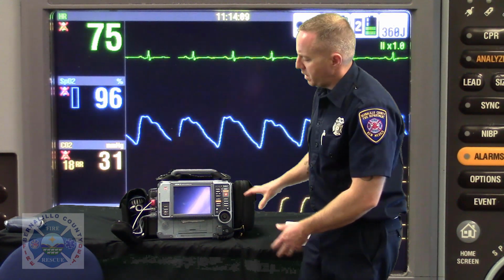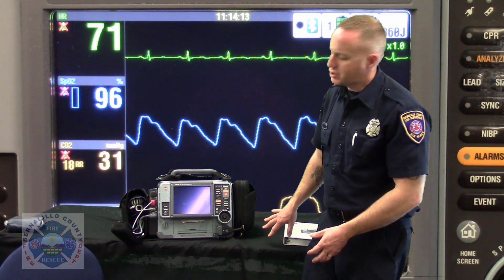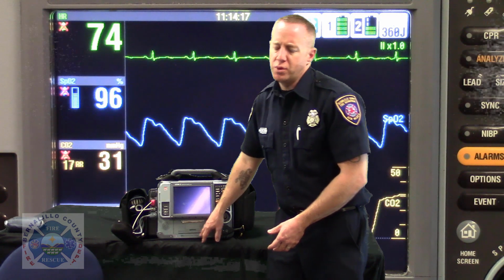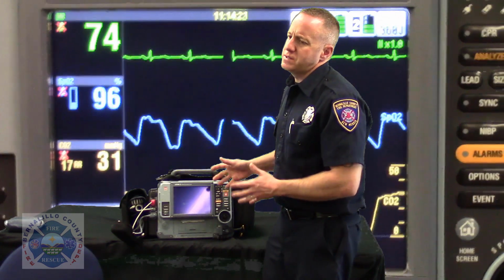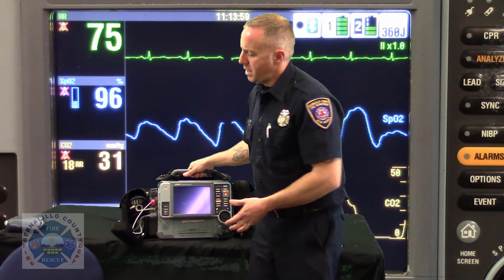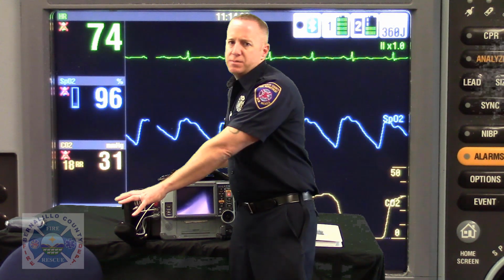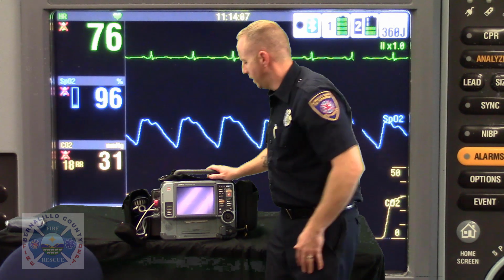If you were to put the patient on the right side, you would see that all of your cables are going to not only interfere with the screen and your button access, but also inhibit the printer, which may give you a bad tracing. So just the very simplest method of putting the patient in a spot and setting the monitor to the patient's left side, you can see how all of your assessment tools are going to pay out to that side, and it's going to leave you nice, good access here.